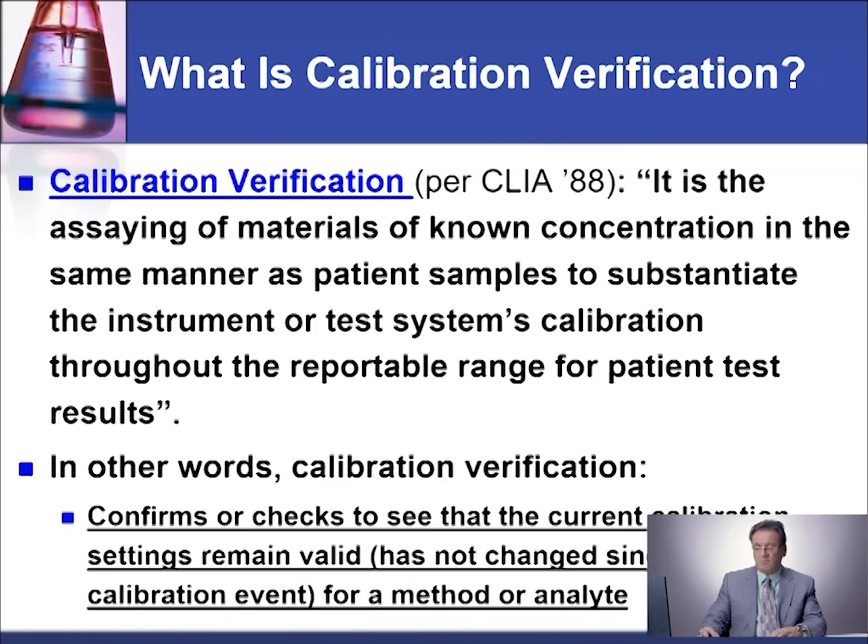In other words, calibration verification confirms or checks to see that the current calibration settings remain valid for the method or the analyte. In other words, just from the name, calibration verification verifies that my calibration for that analyte or test is still working.